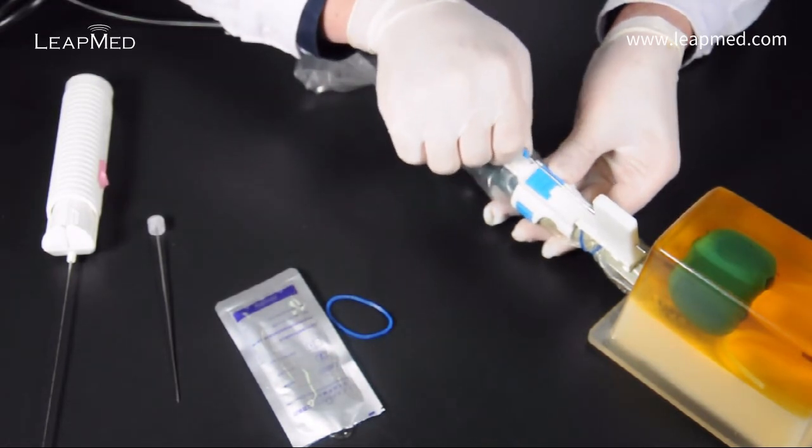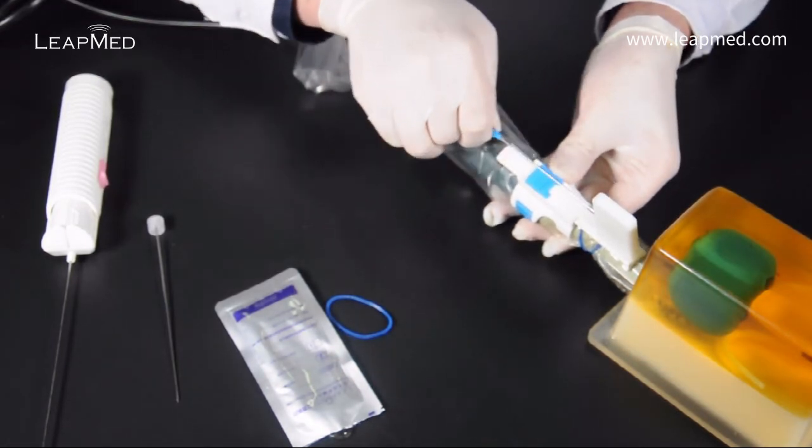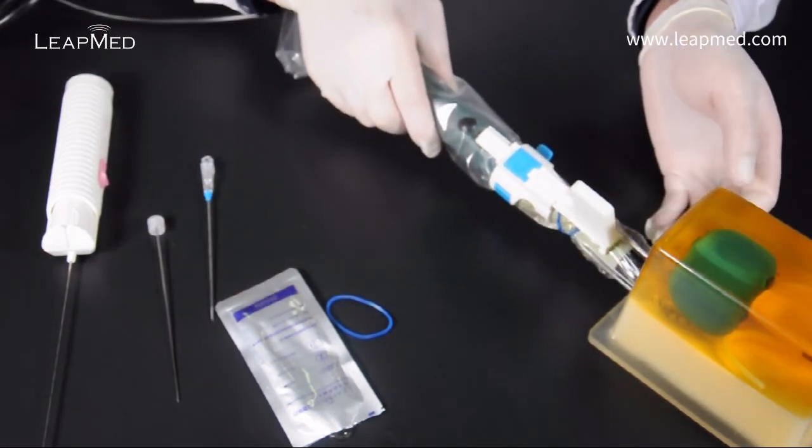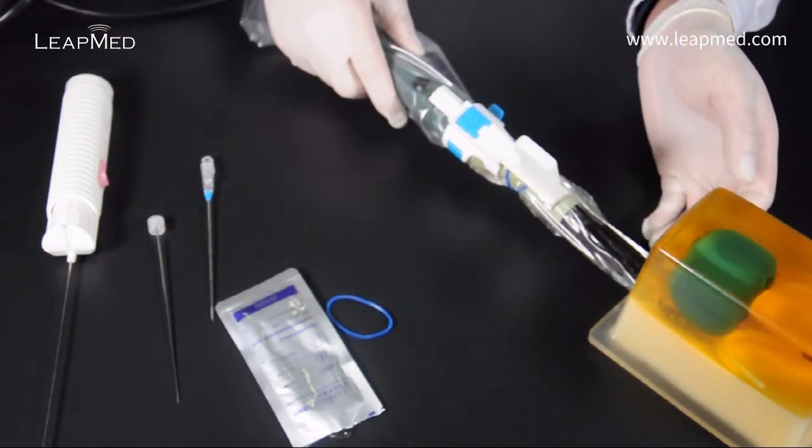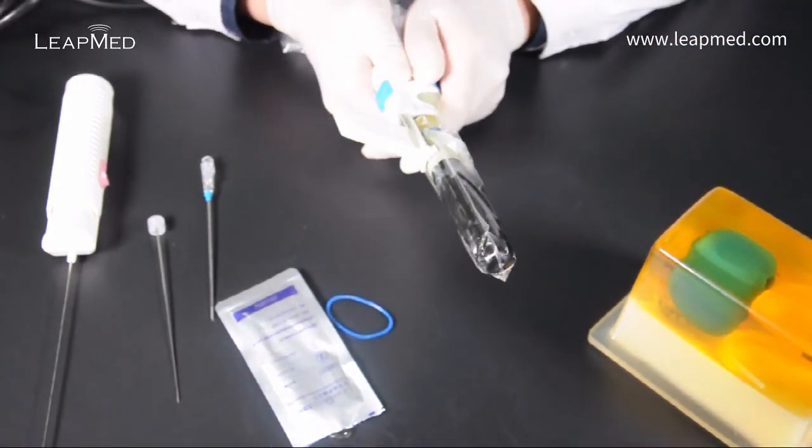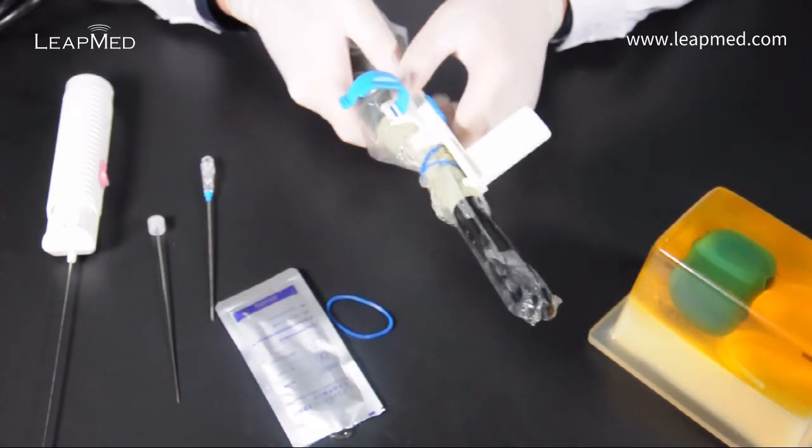Once you've finished the procedure pull the probe from the rectum slowly. Dismantle the guide from the probe. Pull the cover from the transducer and the procedure is complete.